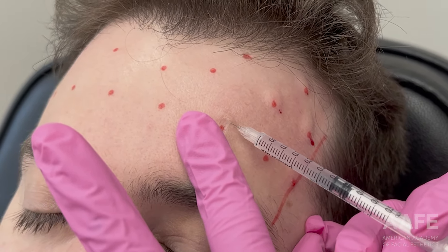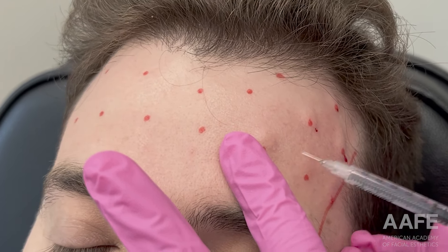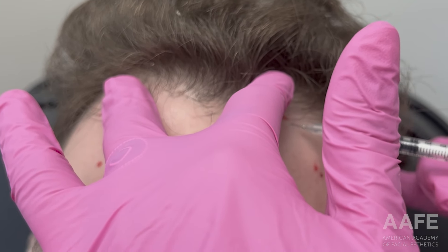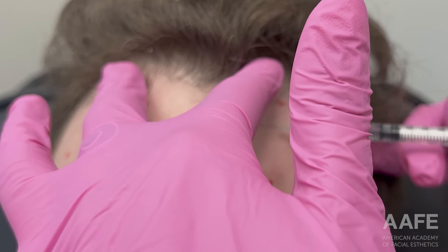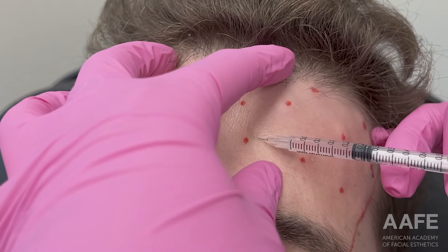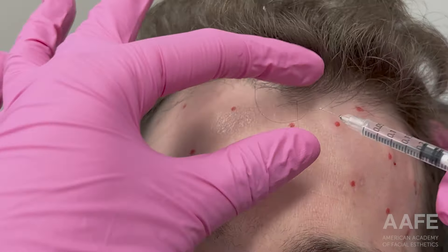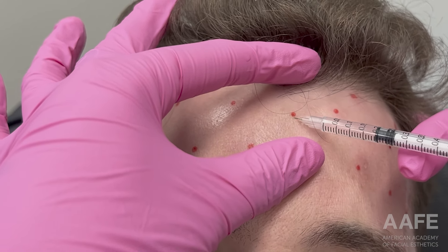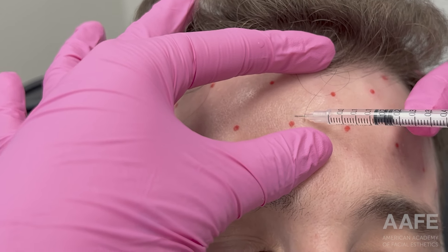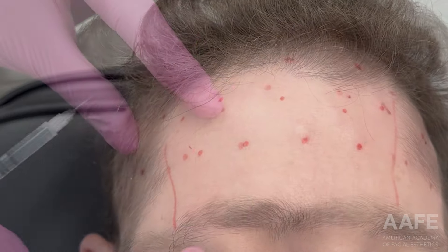I did struggle in some injection sites with resistance because this patient just had really tough skin. You have to know your patient's baseline and assess them accordingly so you know what to expect when you inject. I make my way across the frontalis nice and slow, pushing half a unit in each dot. I diluted my dose to standard so it's easier to inject and ensuring roughly the same amount in every dot for even diffusion of the tox across the frontalis.